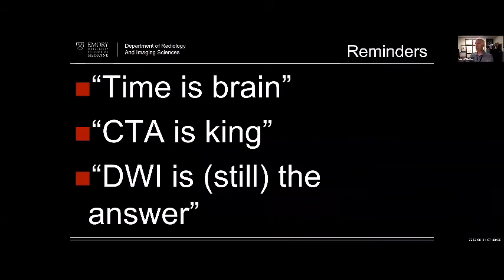So just kind of finishing up, time is brain. So there's the opportunity to do some potential good by focusing on these imaging techniques. Depending on your local practice customs, you might be able to do a CTA. Like we're able to do a CT probably from head to foot. I would say, not that I would hopefully do the entire area, but theoretically we could do that whole area in 30 seconds.